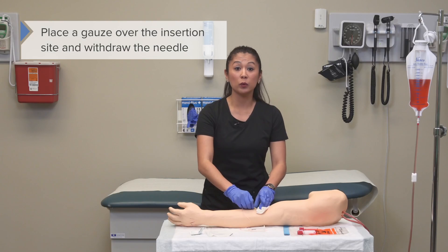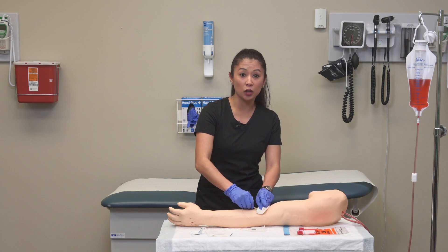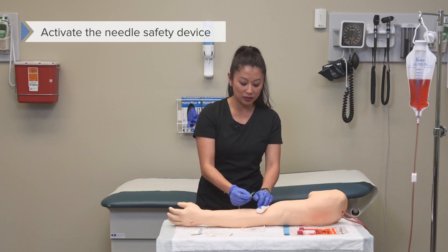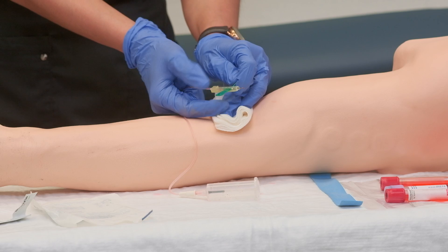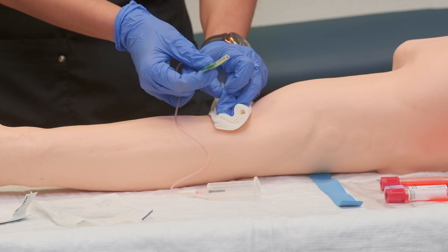Once we do this, we want to go ahead and withdraw the needle — pull it straight out. Then it's really important to activate the safety device. I like to hold my wings and carefully slide the yellow safety device over the needle until it clicks.